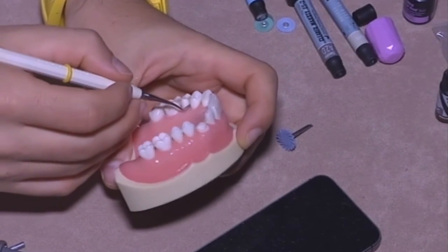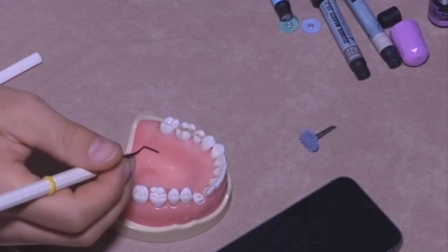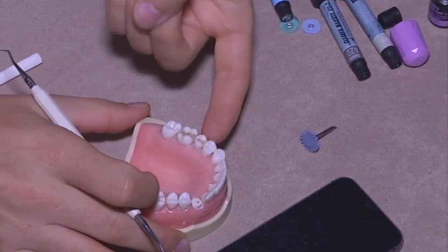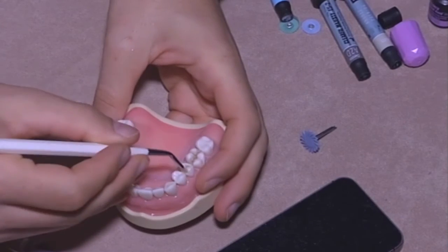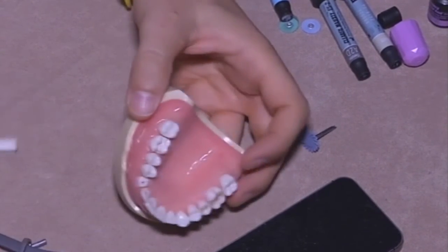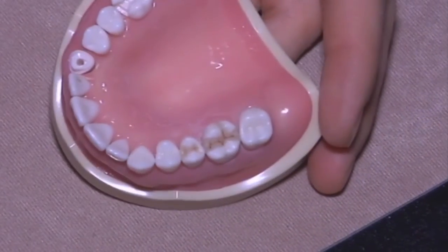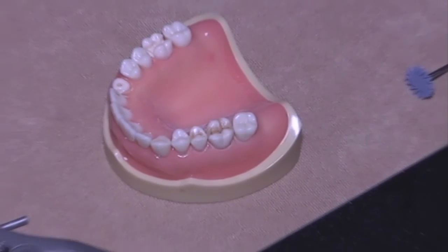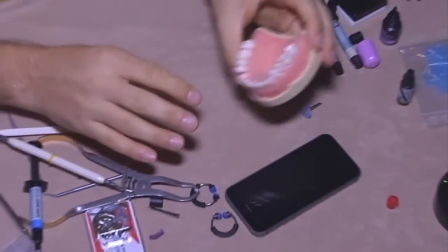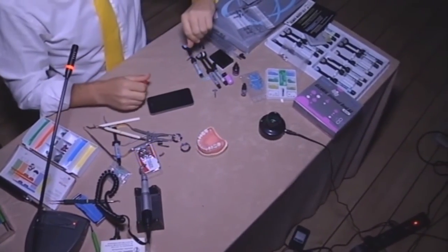Another tool you can use to remove the excess here is the scalpel, the number 12 scalpel, which is a round shape, and you cut there and you remove the excess there. So I think that it's done. I cannot see anything anymore. And if you have any questions, feel free to ask, of course. But I think that these two restorations could work for a long time. Okay? 1 hour, perfect. Come on.